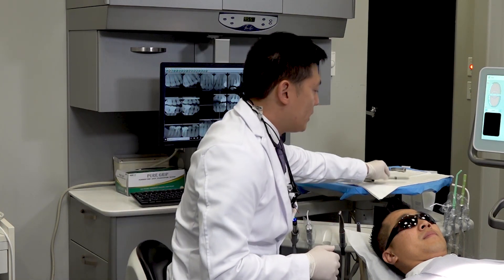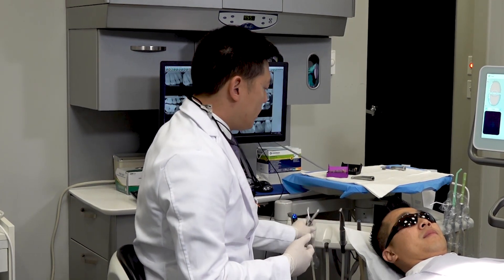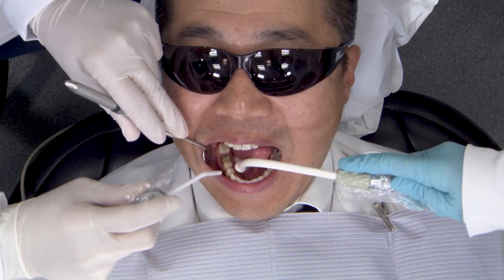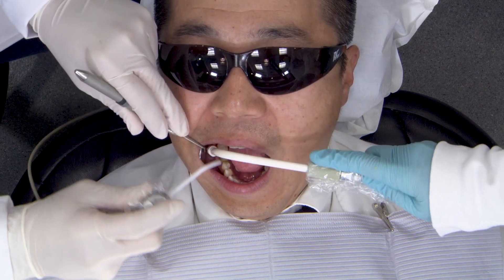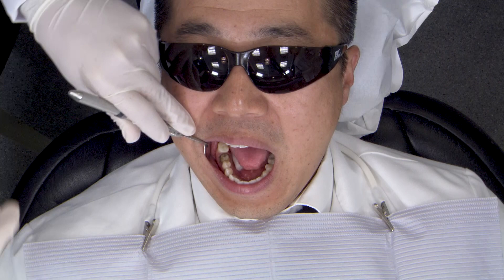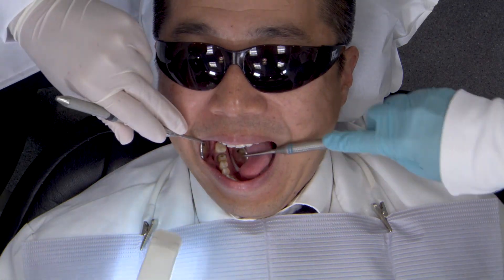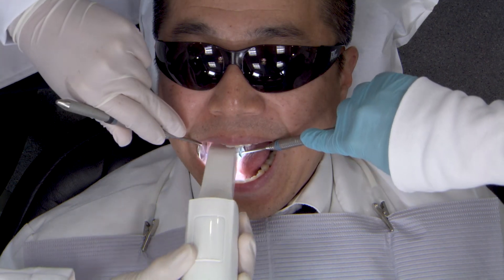To address this, I'll still use my mirror or a retraction aid on the cheek. You also want to ensure — just like with your initial scan — that the teeth are very dry, the preparation is dry, and the critical area you're trying to capture is also dry. Using a mirror to retract the tongue, I have the help of Iliana to keep the tongue retracted.